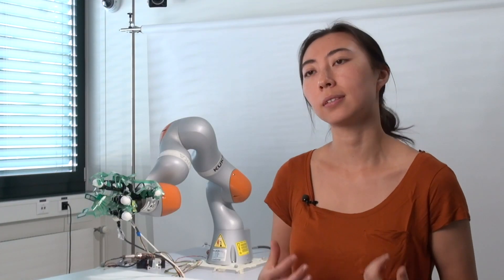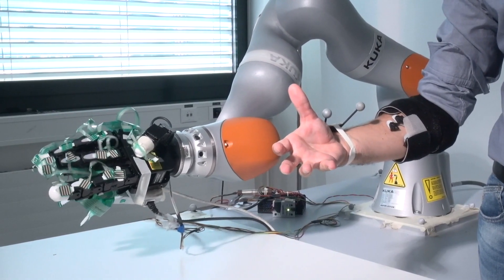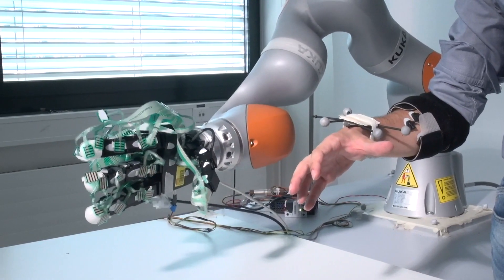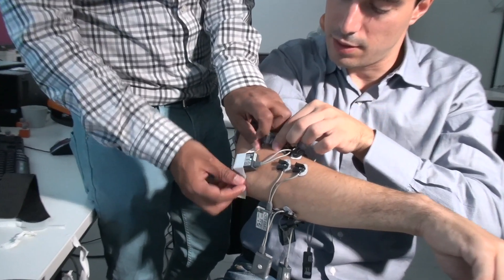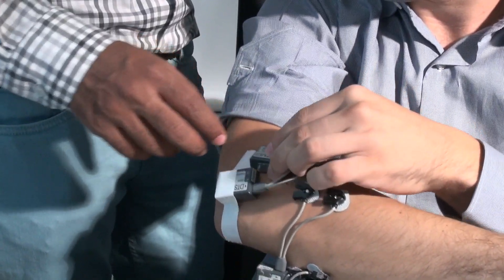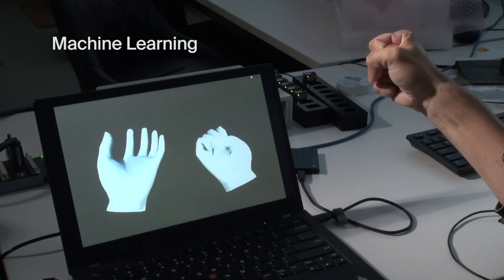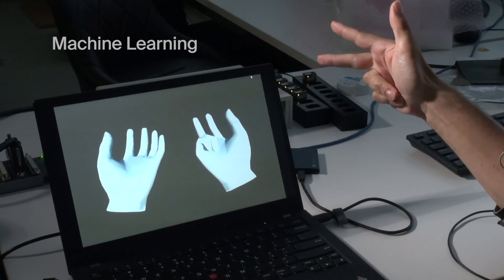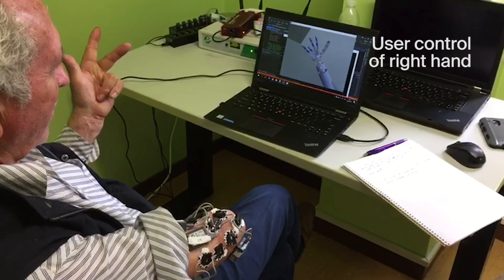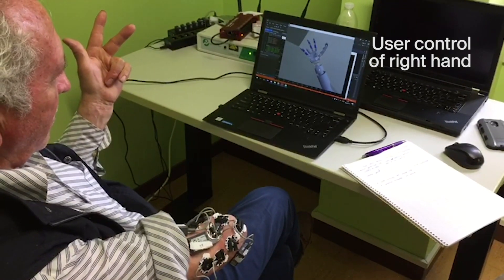For an amputee it's actually very hard to contract their muscles in many different ways to control all of the ways that our fingers move. So what we do is put sensors on their remaining stump, record them, and try to interpret what the movement signals are. Because these signals can be a bit noisy, we need a machine learning algorithm that extracts meaningful activity from those muscles and interprets them into movements that control each finger of the robotic hand.